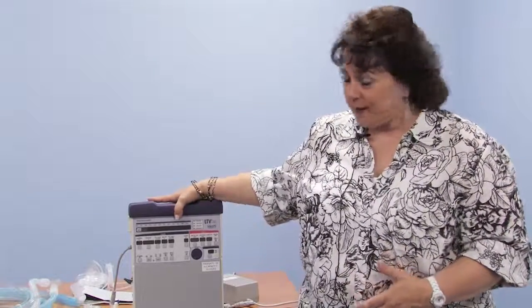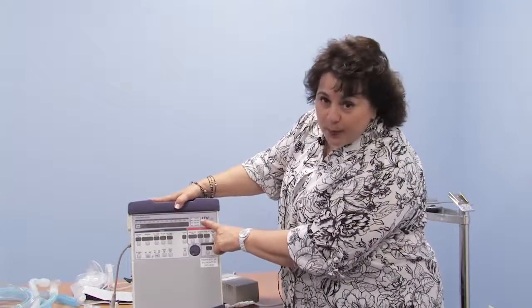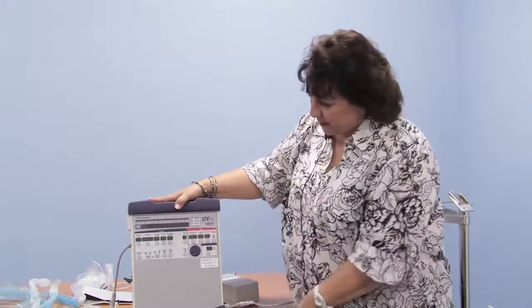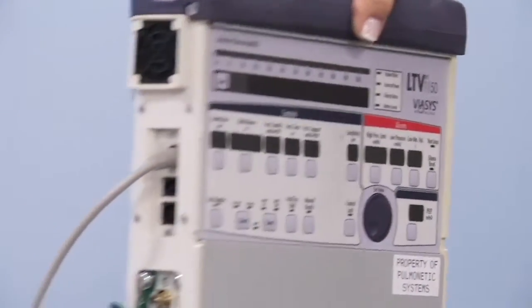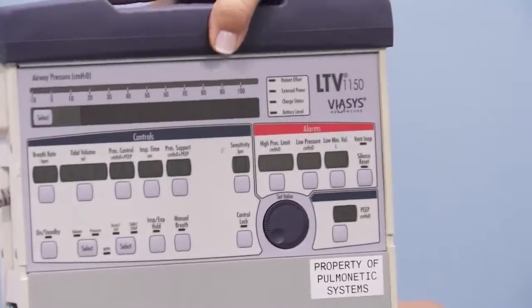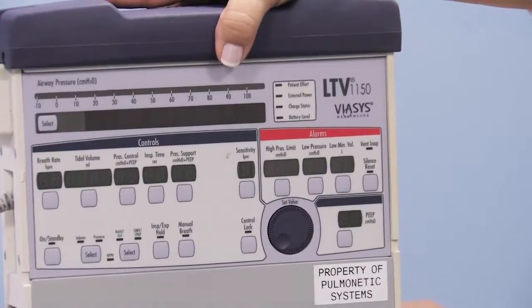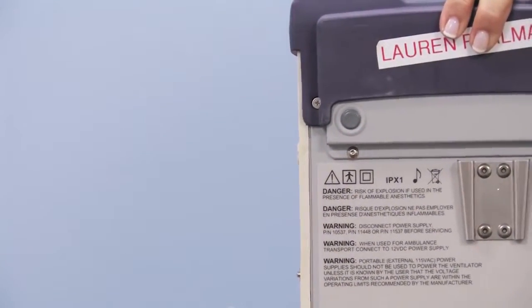The one thing that I think is most important to start with is, how do I get power to the machine so I know it's going to work? Both machines have an area here, and if you look, it says external power with a light, charge status with a light, and battery level. If I turn the machine on, the battery level light comes on if it's not plugged into anything. That is only telling me with an illumination of green, amber, or red how full my 1 hour or less internal battery is. In the rear of the machine, this is the 1 hour internal battery.